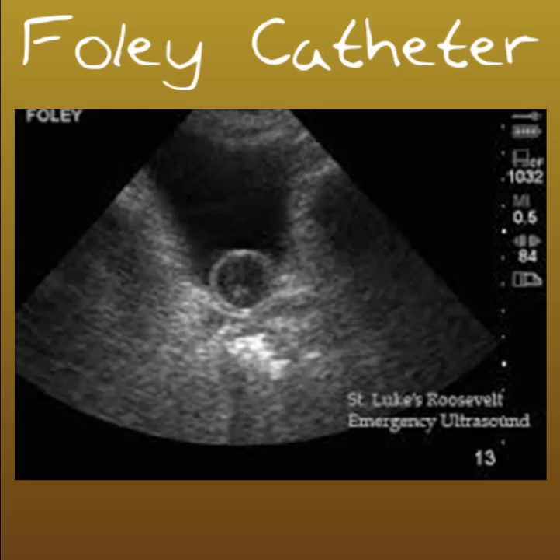I had mentioned Foley catheters earlier, that these are a very common finding in our inpatient renal studies. When you're scanning through the bladder, you will see this little bubble down here, and you should know if they have a Foley catheter in. They come along with a urine bag to hold the urine as it empties out through the catheter. As I had mentioned, a tube is inserted through the urethra. This bubble is deflated at that time.